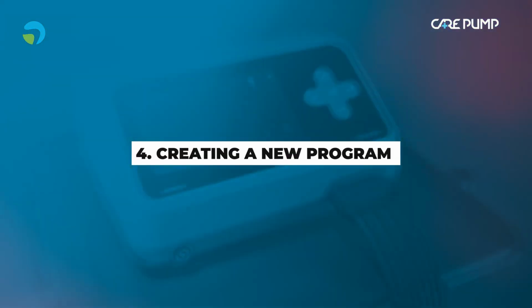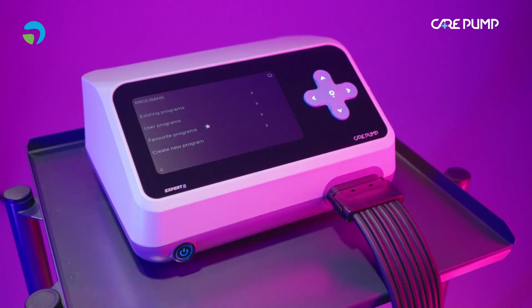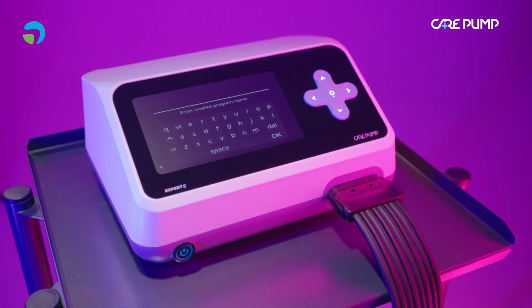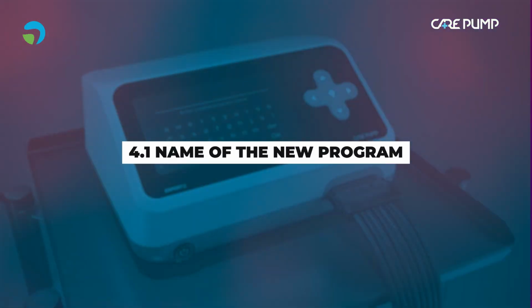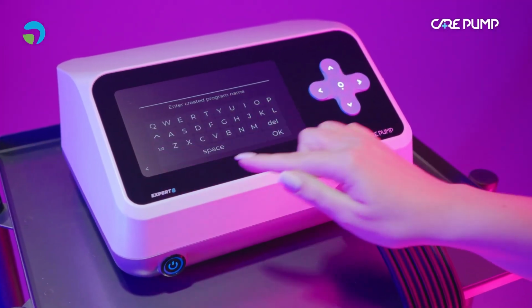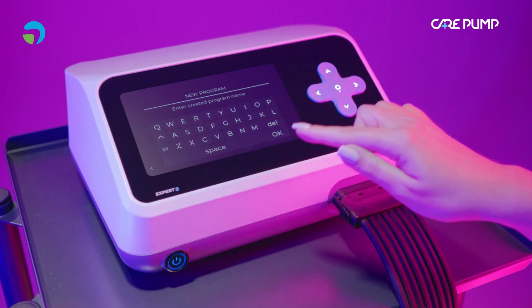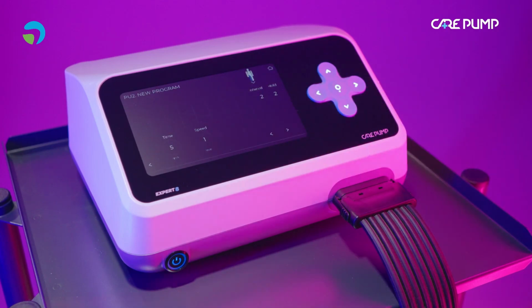Creating a new program. Press Program icon and select Create a new program. Name of the new program. Enter a name of the new program using the keyboard displayed on the screen and confirm by pressing OK.